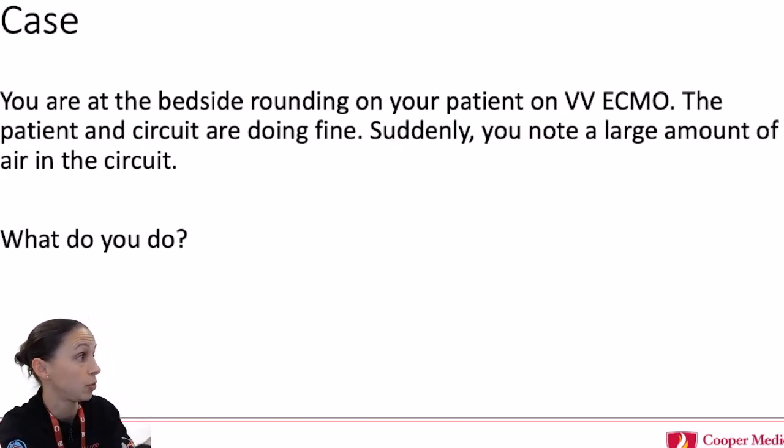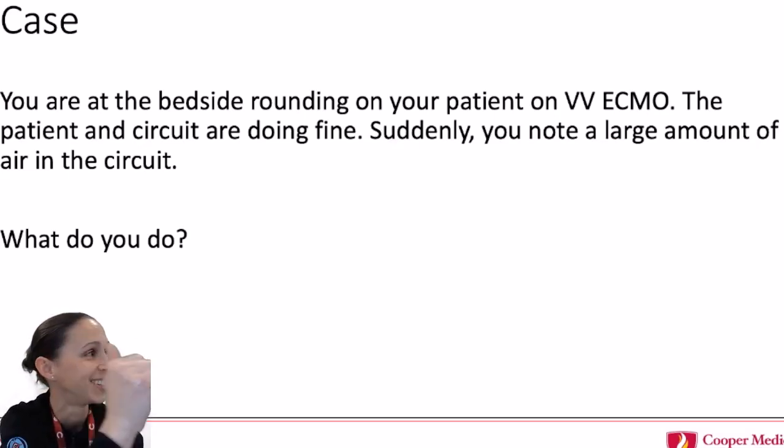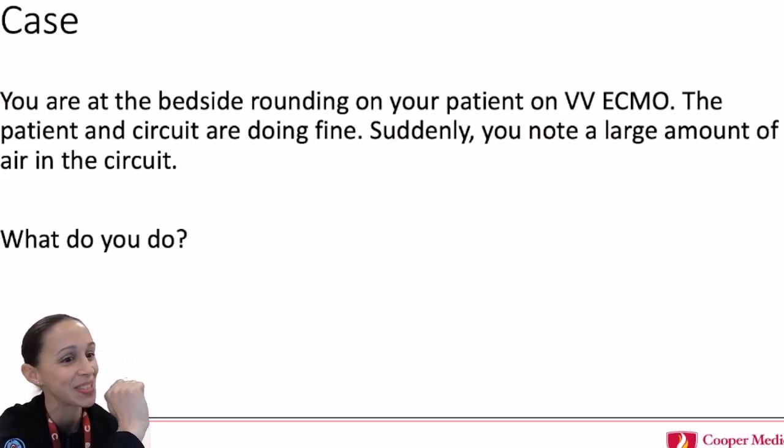If part of the tubing is entraining air, that is the negative pressure side of the circuit. So you may have to clamp off, and that's actually relevant to this scenario. Do you want to say anything else about that? Yeah, that's the scenario for Mr. Gingerbread Man.